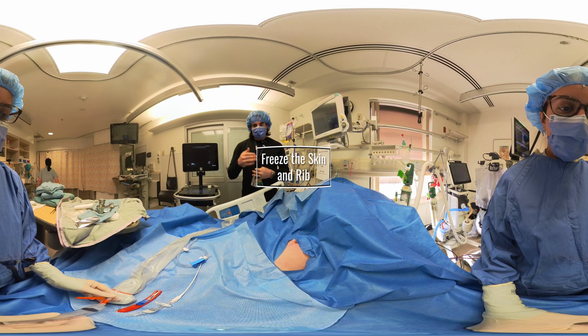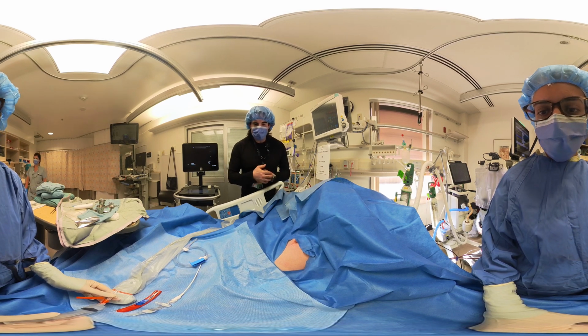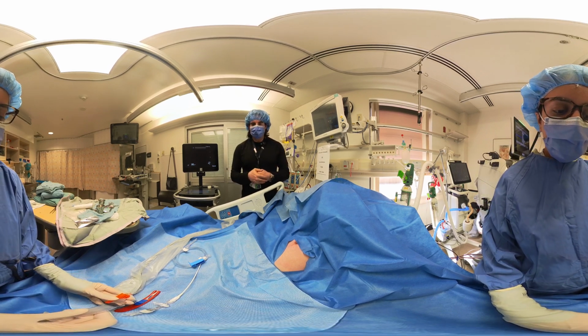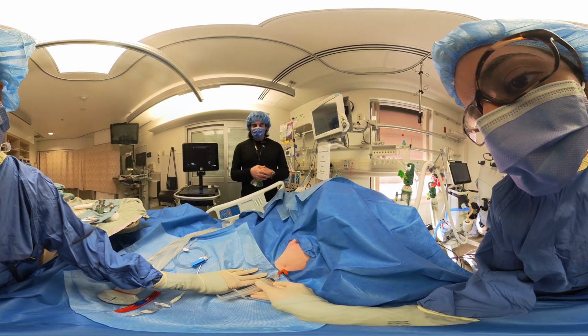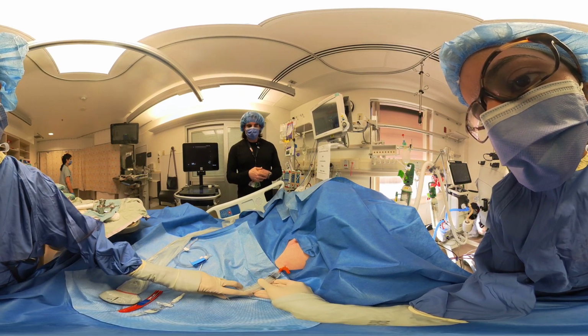The next step from here, step 1, is that we've landmarked the area beforehand with static guidance. Let's freeze the skin and then the periosteum of the rib, and get down to the pleural space and make sure we're happy with our trajectory. Okay, you may now proceed. Excellent, so we'll make a little bleb in the skin and just freeze.